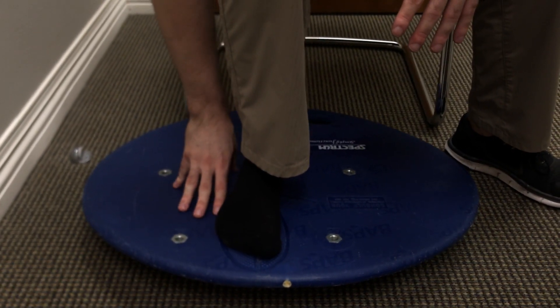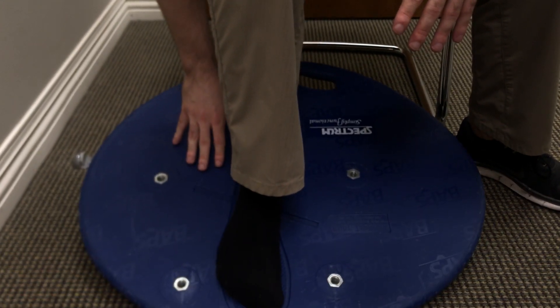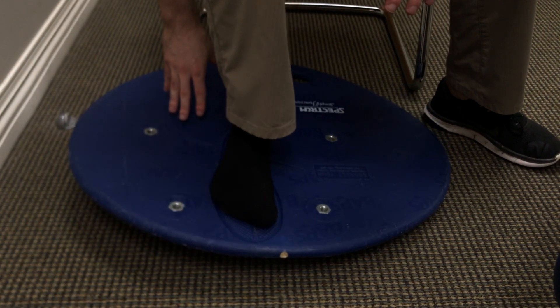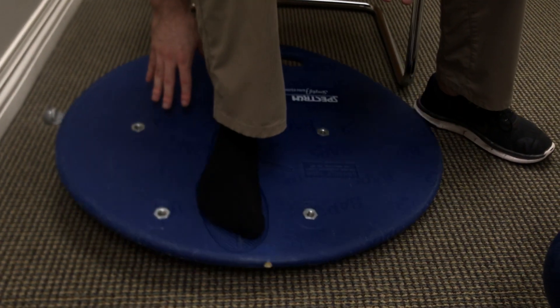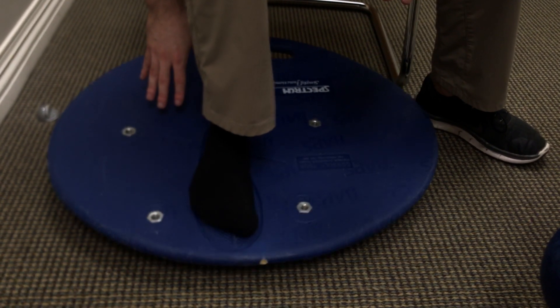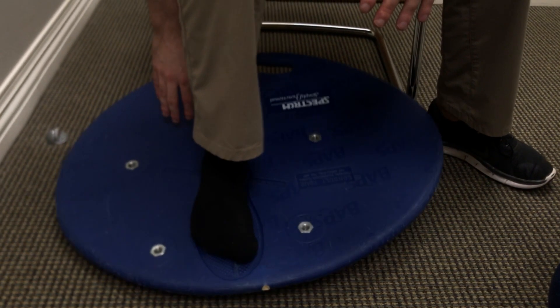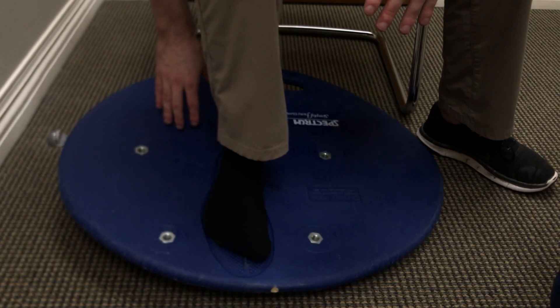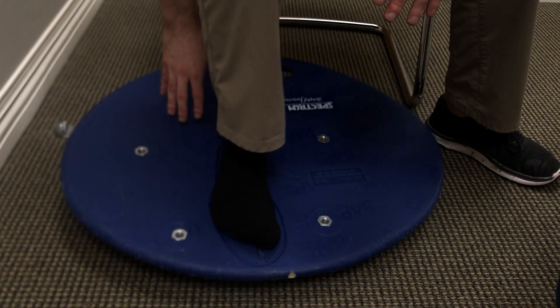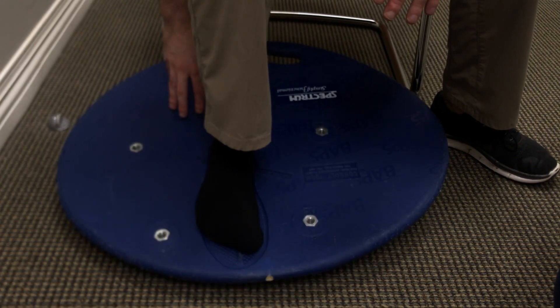The motions they're gonna do — they want to touch the rim of the board to the floor in slow and controlled motions. You want to try not to wobble uncontrollably. So you can go forward and backward, side to side, and then around the whole rim of the board both clockwise and counterclockwise.